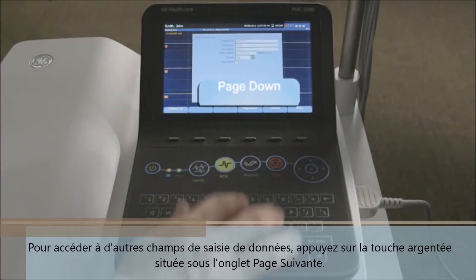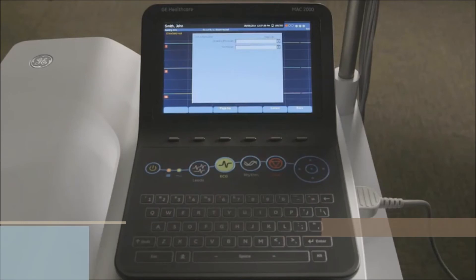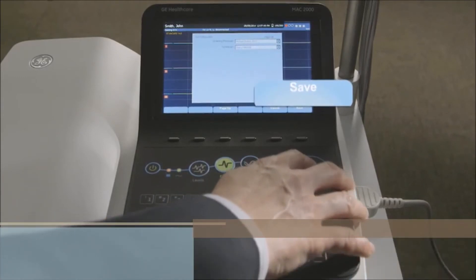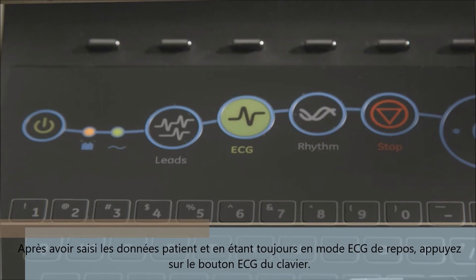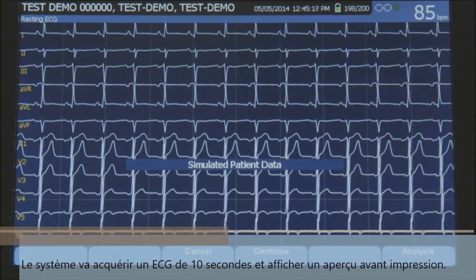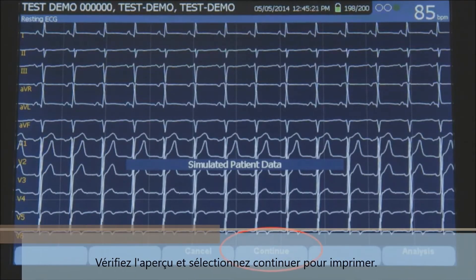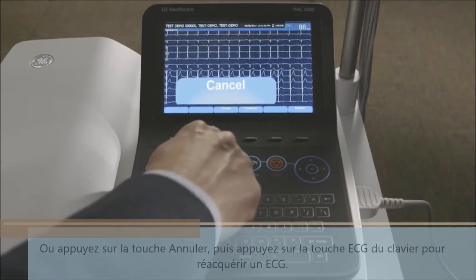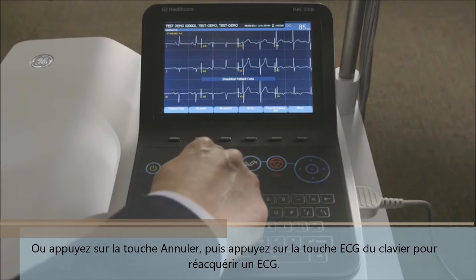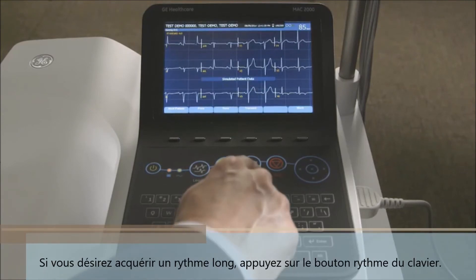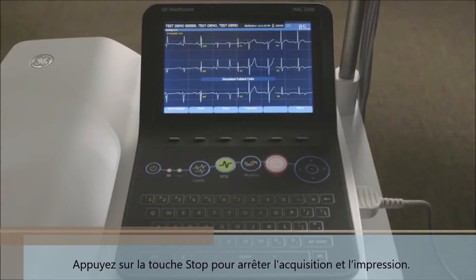To advance to other data entry fields, press the silver key beneath the page down tab. Once data entry is complete, press the silver key beneath the save tab. After entering patient data and while still in the resting ECG mode, press the ECG button on the keypad. The system will acquire a 10-second ECG and display a print preview. Review the preview and select continue to print, or press cancel then press the ECG key to reacquire a 12-lead ECG. Press the save key to store the ECG. If a rhythm strip is to be acquired, press the rhythm button on the keypad, then press the stop key to stop the writer.